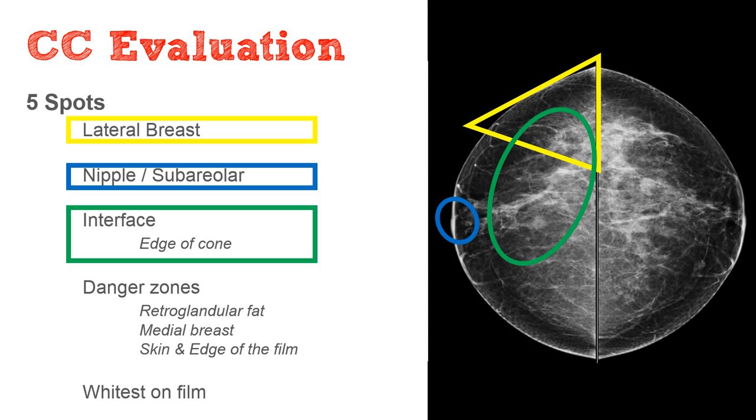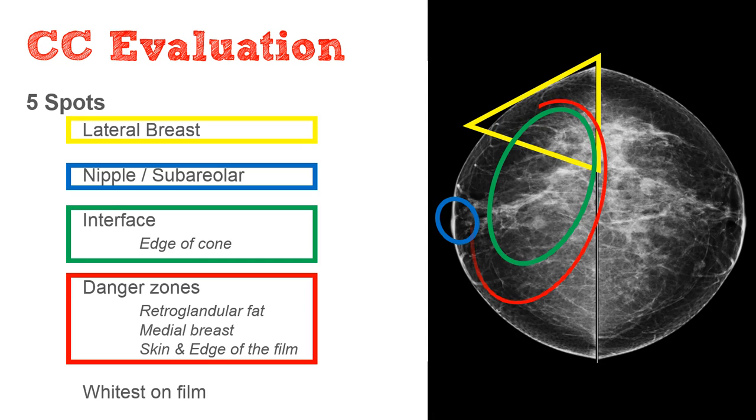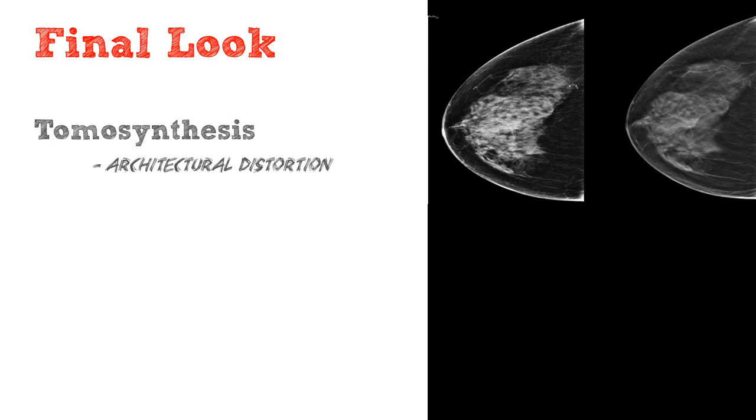From here, we want to look at the danger zones, the areas of fatty tissue where nothing should be present. This includes the retroglandular fat, the medial breast, and again, looking at the skin and edge of the film for any subtle findings. Finally, once again, we want to look for the whitest thing on the film.